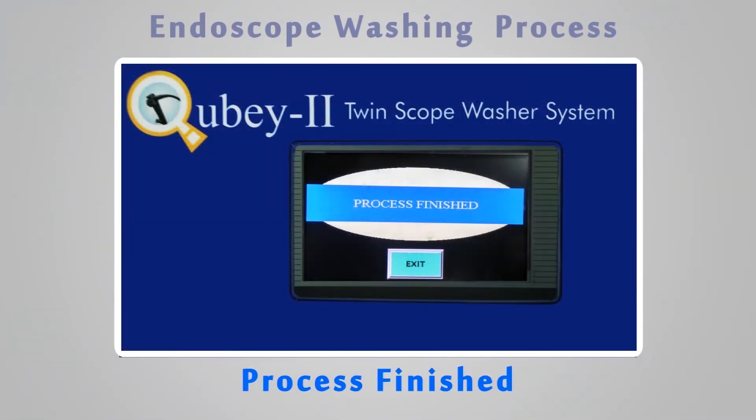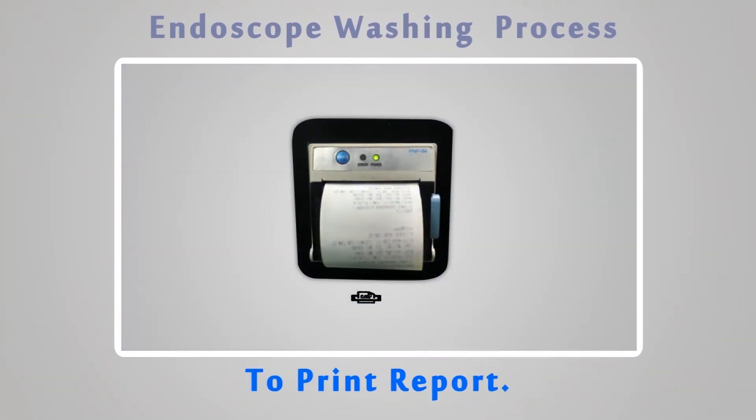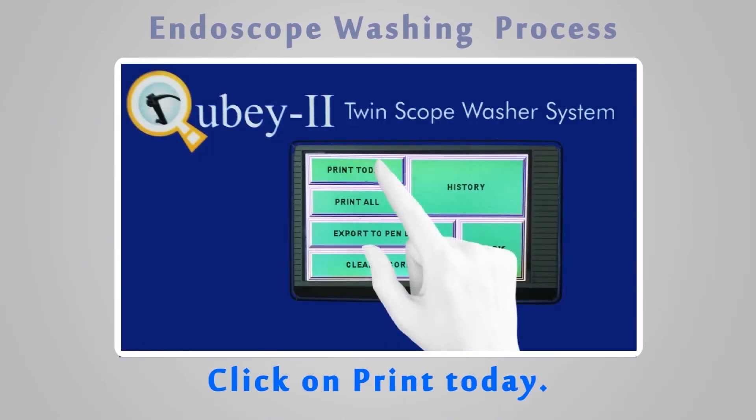Process finished. To print the report, click on Print Today.